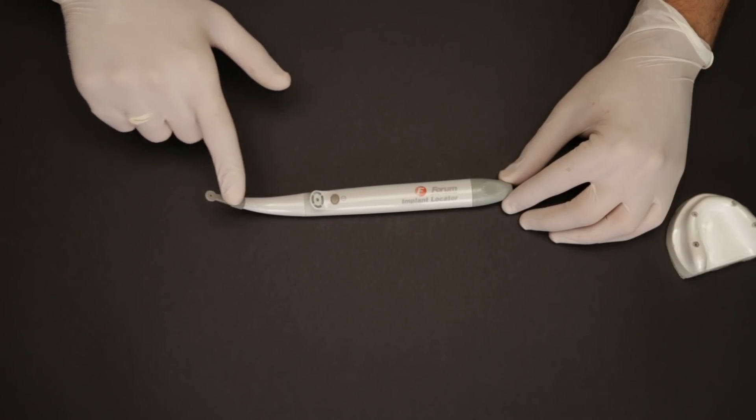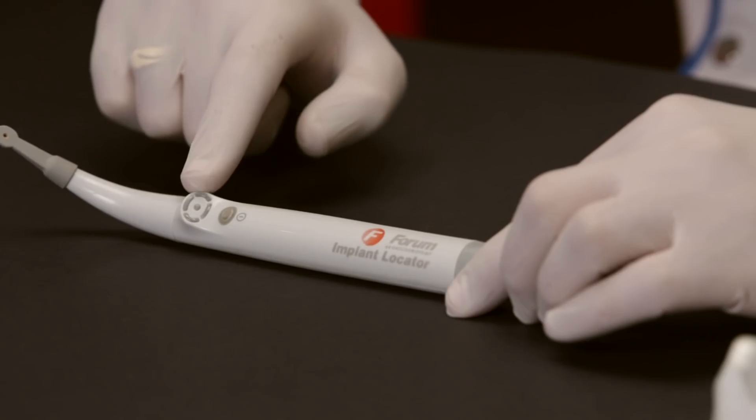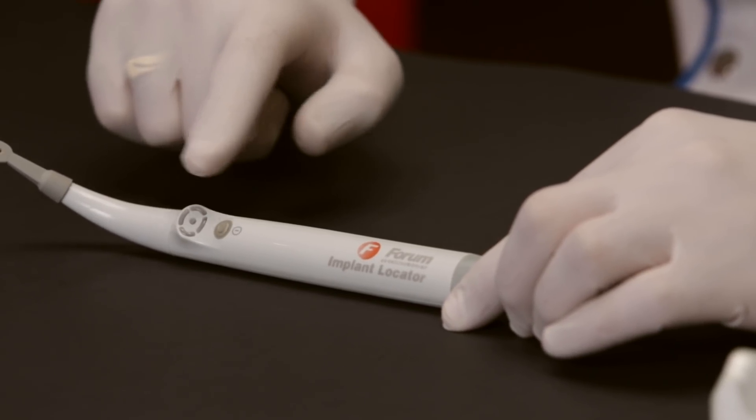This device works on a simple AA sized battery, making it very light and portable. It has a light segment here and an on and off button.